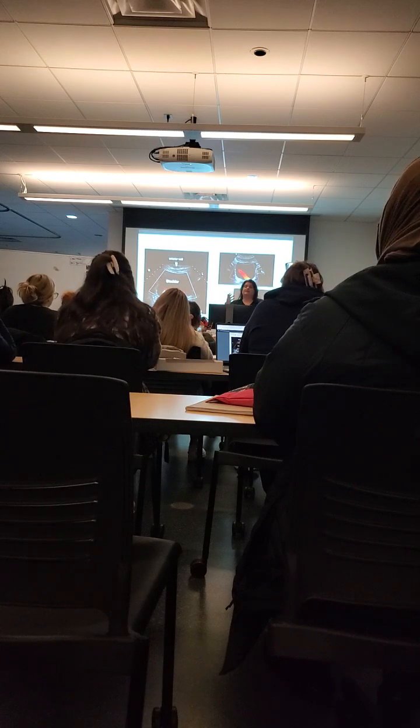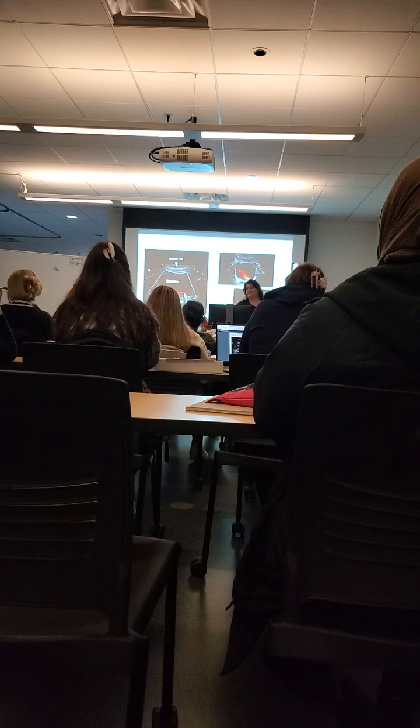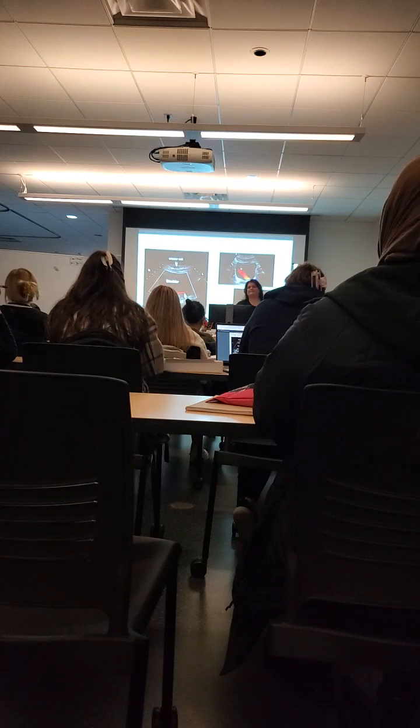Because it's movement. It's not necessarily whether you are an artery or vein, right? It's all about the movement. And since it's coming towards the probe, most of the time it's going to be red. So it's urine. But then how would I know if it's urine or a vessel? There's no vessels inside the bladder, so you're going to know it's urine, and everything next to it if it has color. If it's a vessel, you can see there's a vessel right here picking up. Usually the vessels are going to be down here. But there's no vessels inside your bladder.